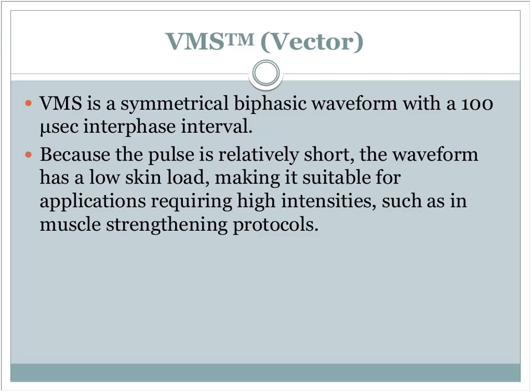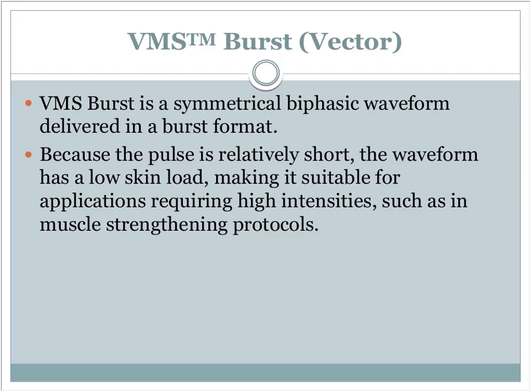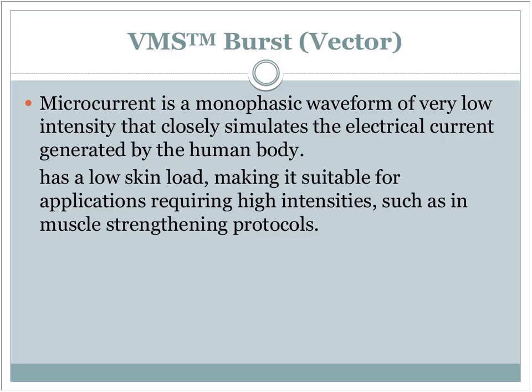So this one is just trademarked. It works, nothing wrong with it. But you have Russian in the Transport 2 unit, and it will usually work just as well. Then they've also created a burst form of this, which is just the same exact thing delivered in bursts. Boom, boom, boom, that kind of thing.